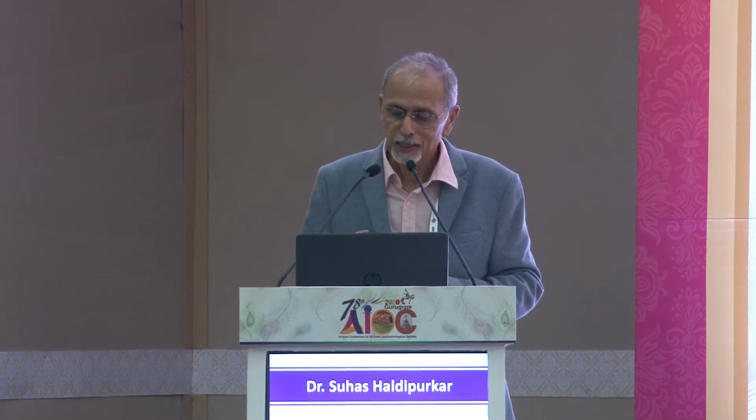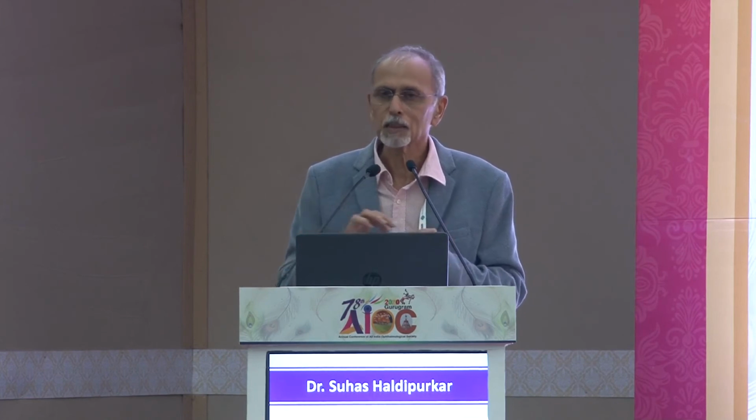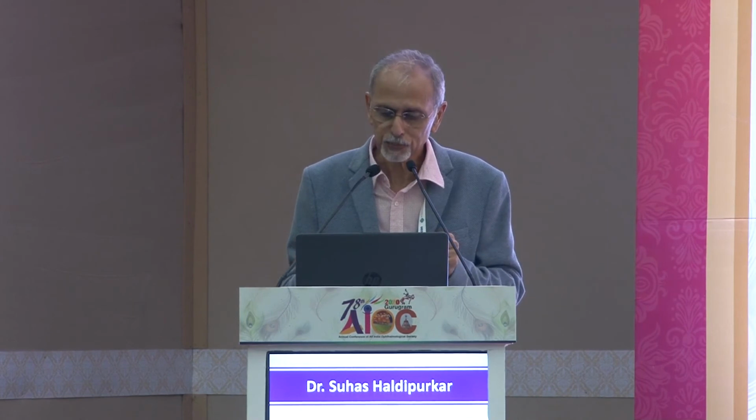And then what I have done is I have created a Hoffman pocket. Now a Hoffman pocket is a simple thing. You take a 300 micron depth blade and create a groove on the limbus and dissect it in a reverse way. The only purpose of doing that is to avoid suture knots coming outside.